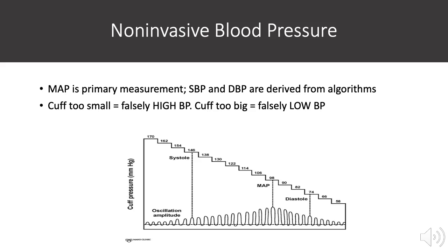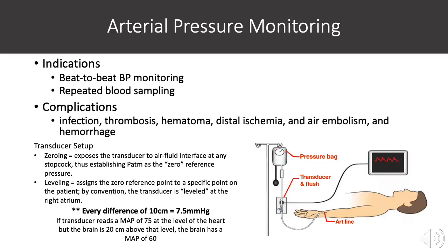If the blood pressure cuff is too small, the blood pressure will be falsely high. If the cuff is too large, the blood pressure will be falsely low.